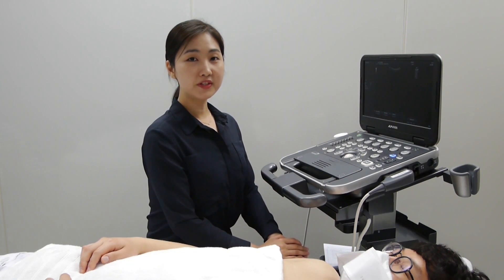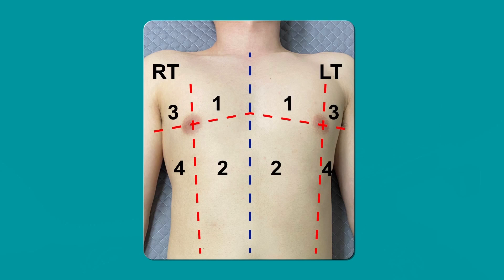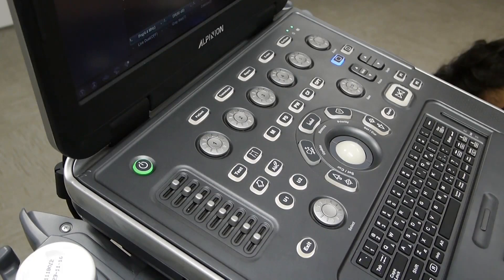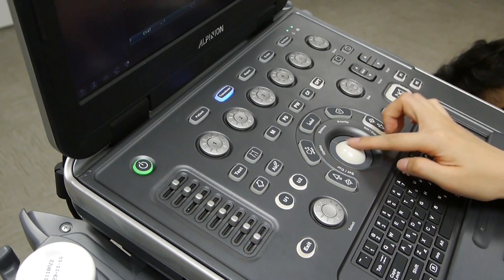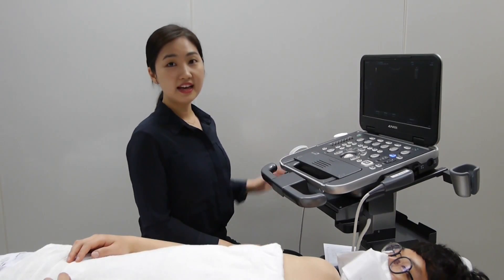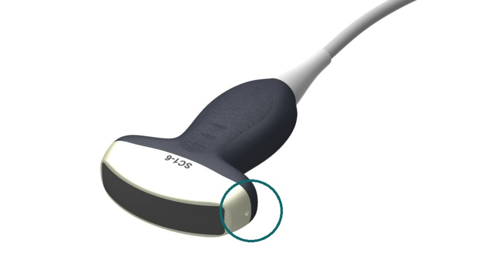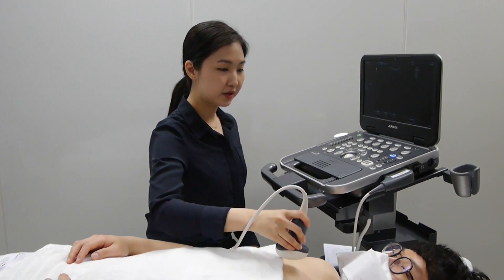Now we are going to start scanning. Before we start, we are going to divide the chest into eight sections — four sections for each side. First, you need to choose your transducer and a preset. With your transducer, you need to know where your marker is. This indicator should be oriented towards the patient's head or the right side.